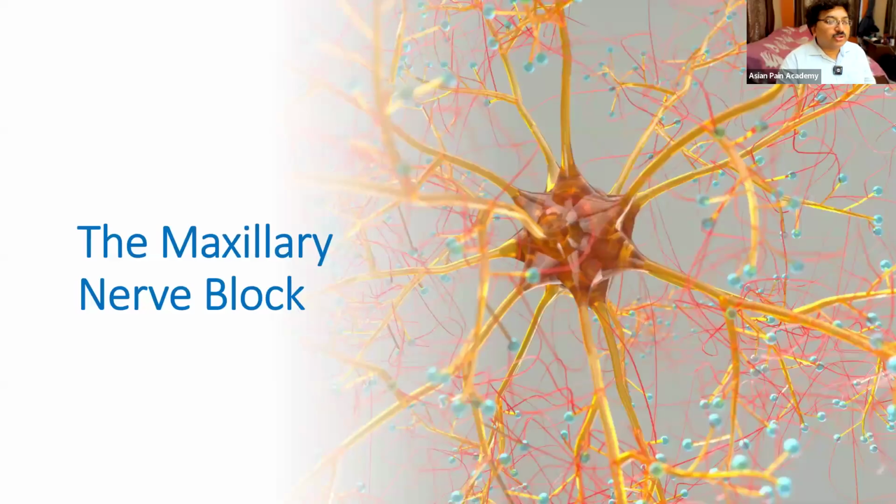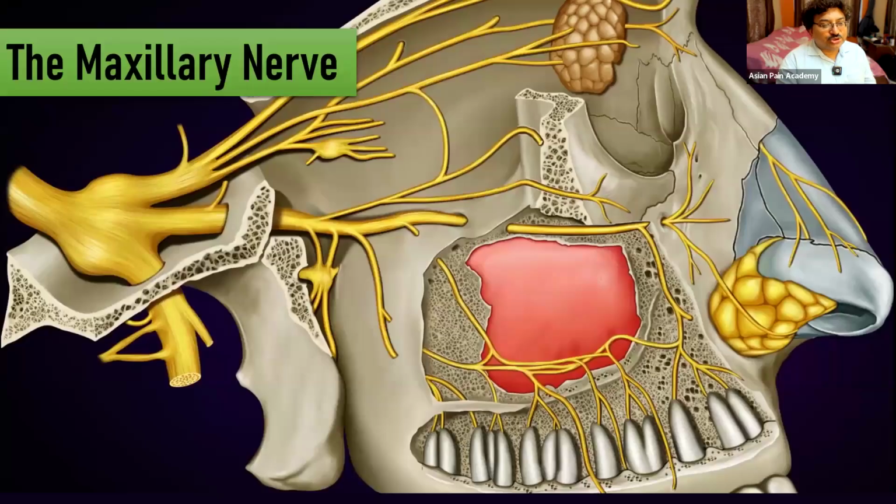So next we'll be moving to the next block, that is the maxillary. Now one thing we should remember is that the maxillary nerve block is a comparatively deeper block, so we can find out the area through which we have to enter, but internally there are so many branches of the arteries. It is very difficult to specifically differentiate the internal maxillary artery, which is supposed to be differentiated when we are doing the maxillary nerve block under ultrasound guidance.